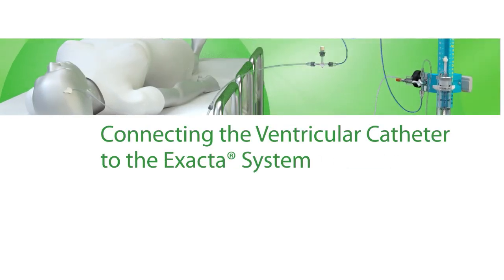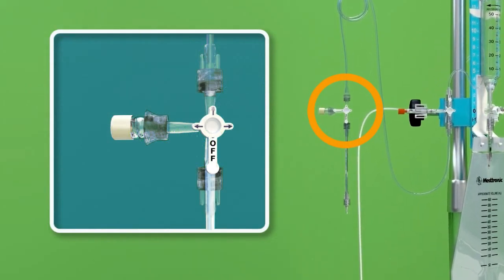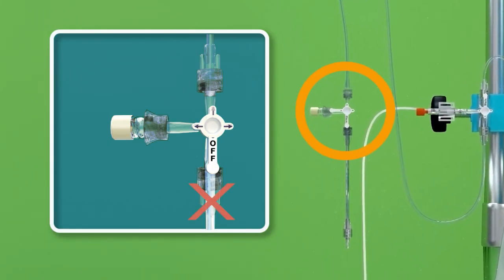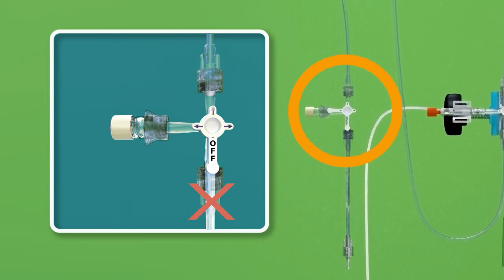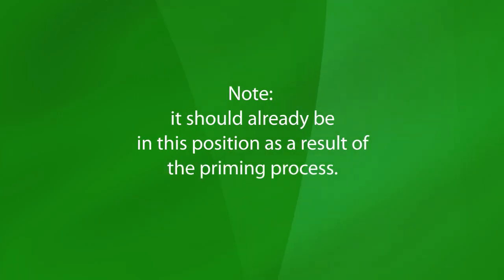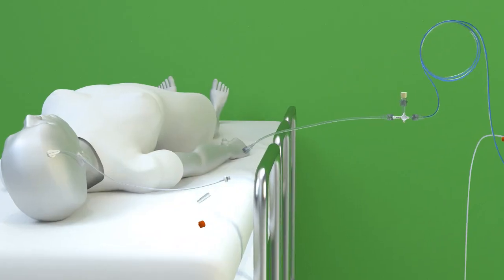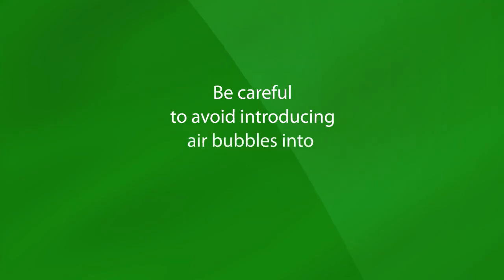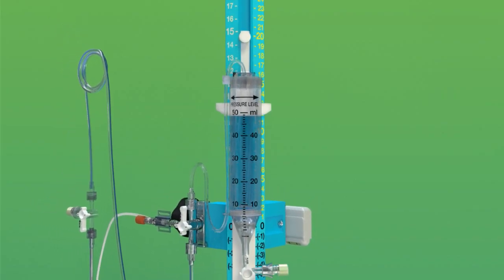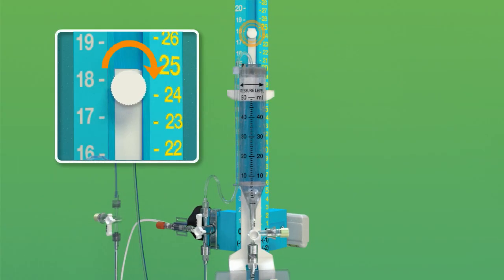Connecting the Ventricular Catheter to the Xacta System. To connect the ventricular catheter to the Xacta system, set the patient line stopcock handle inscribed with the OFF indicator toward the patient, cutting off flow from the patient catheter. Note, it should already be in this position as a result of the priming process. Remove the patient line end plug and attach the catheter to the luer adapter. Be careful to avoid introducing air bubbles into the line. Ensure that the drip chamber is set to the pressure level as prescribed by the physician and is locked into position by tightening the thumb screw.